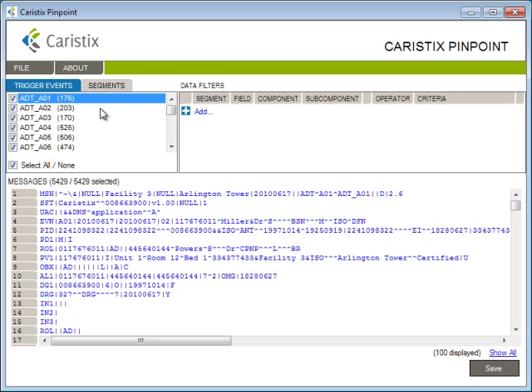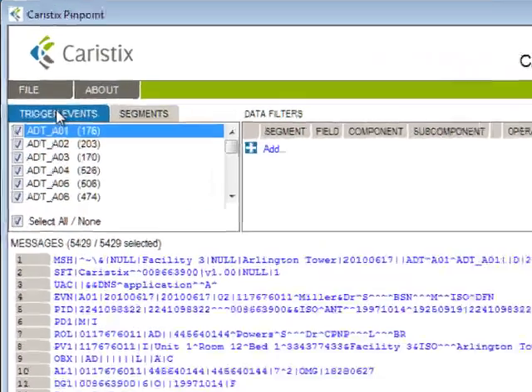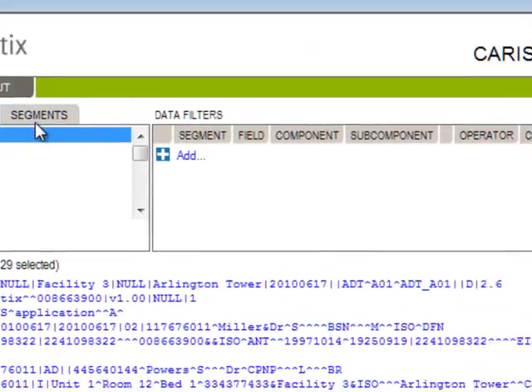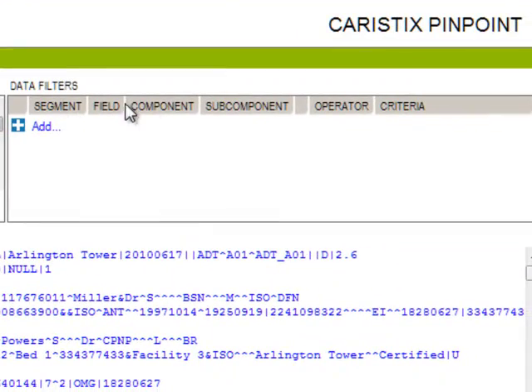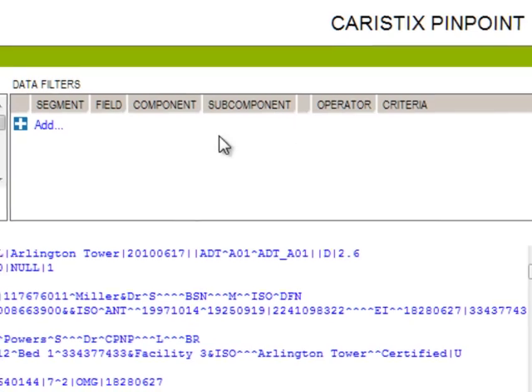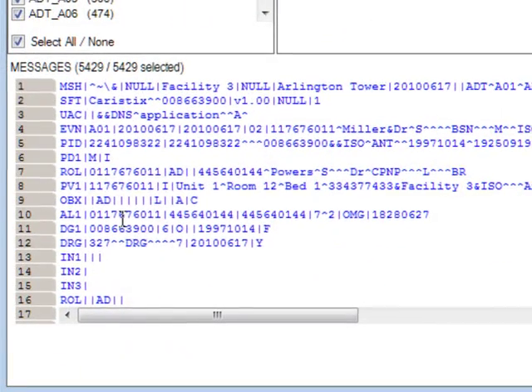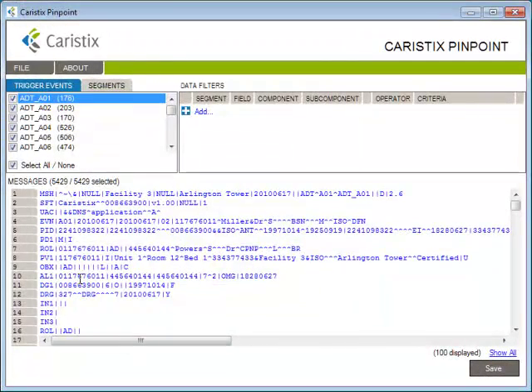Here's what you see when you open Pinpoint: the trigger events tab, the segments tab, the data filters area, and the messages area. We'll walk through the interface throughout this tutorial.